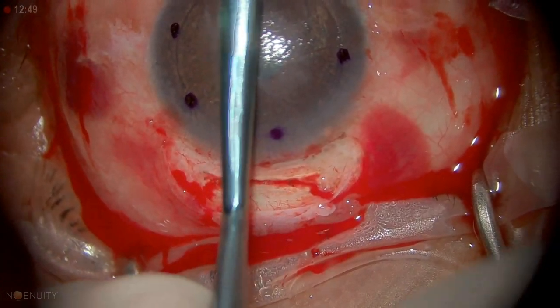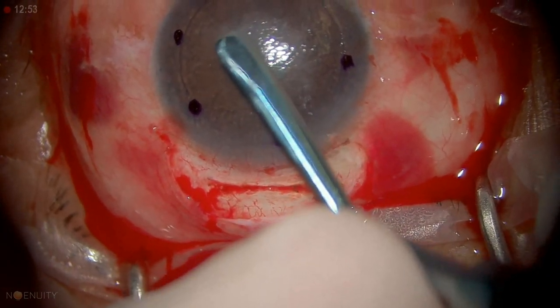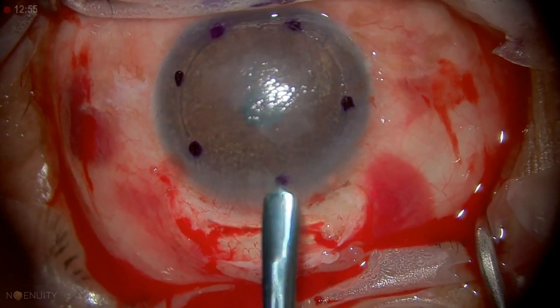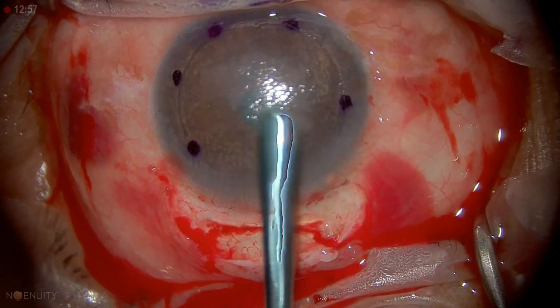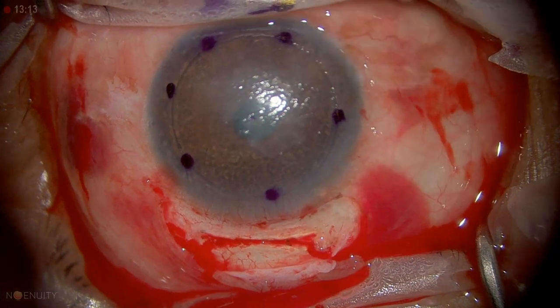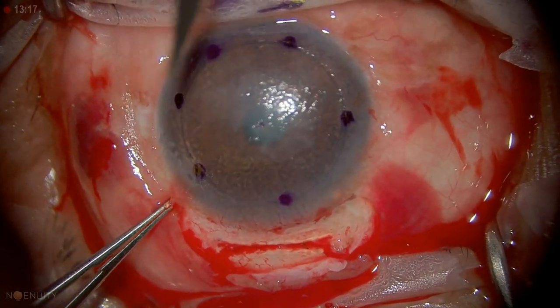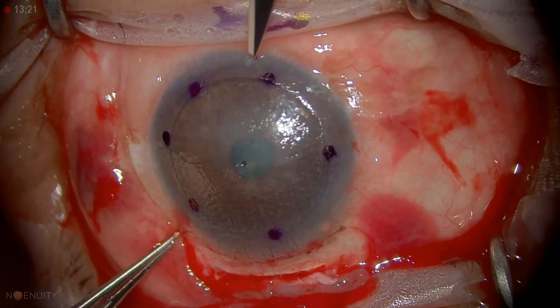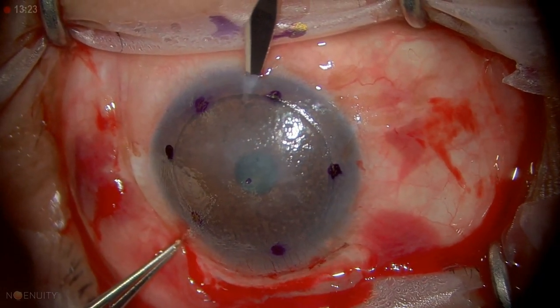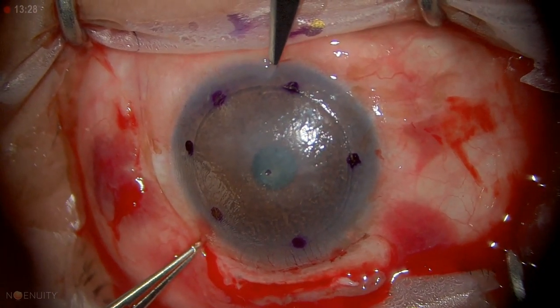Before I do the dissection, I have to put air in the anterior chamber so that the eye is firm. If I try to do it with a soft eye, Descemet's membrane is more likely to bunch up and then tear. So I'm going to fill the AC with air — I'll make the incision inferiorly, rotating the eye down, and make a little stab incision at the limbus. Now I'm in the eye, letting aqueous out.